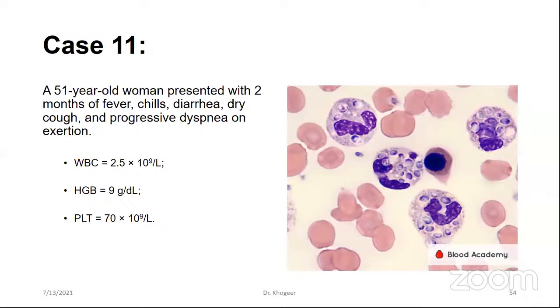As clinicians in hematology and oncology, we want the slide in a system, the same as a radiology picture. And I think this is something again under digital pathology and artificial intelligence. So hopefully in the future, we can reach this point and upload all the morphology in the system.